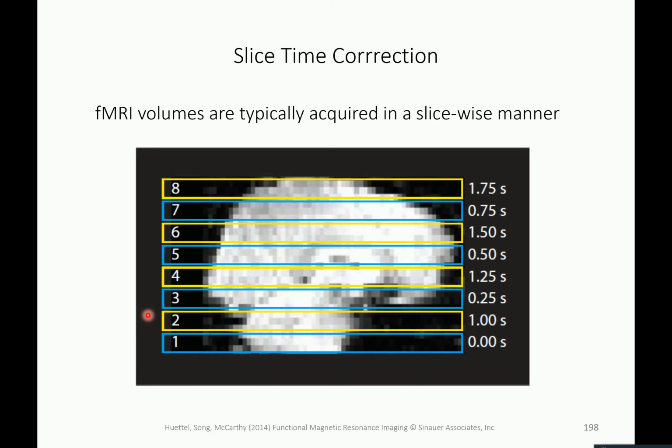The thing is, and we will discuss that in more detail in January, that usually you do 2D Fourier imaging. So you identify a slice based on its Larmor frequency. You remember that this is the Z direction.